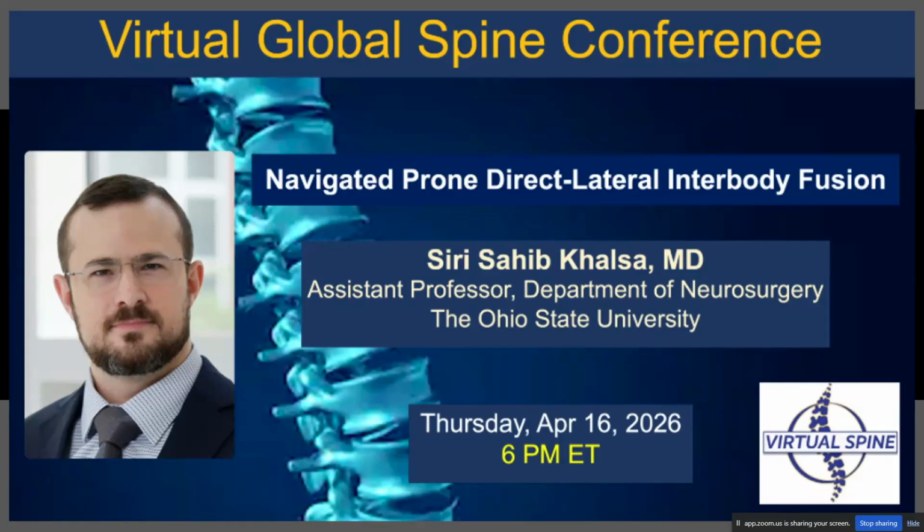Yeah. So number one thing with a prone lateral corpectomy is that you treat it like two prone laterals initially to access the disc, and the risky part is really accessing the vertebral body because you need to be able to control that segmental. Other than that, it's actually a beautiful technique because with the prone lateral corpectomy, if there's bony fragments, so it's an old non-union of a fracture, or there's something that's heading towards the canal, it sort of falls down and it's much easier to get it.